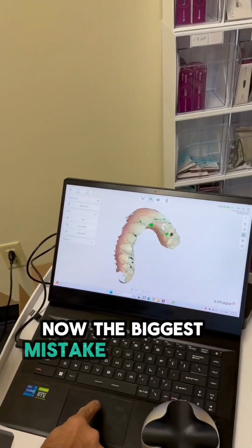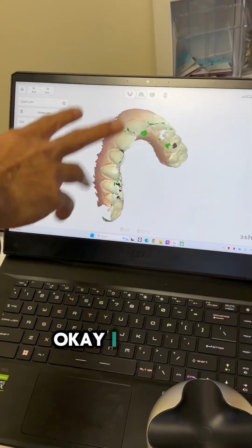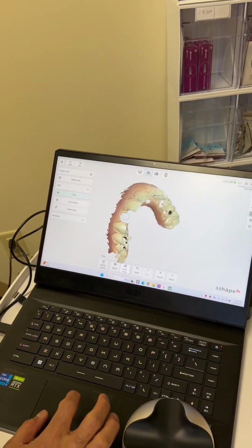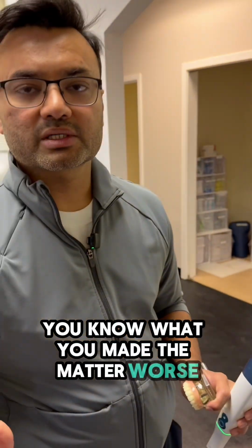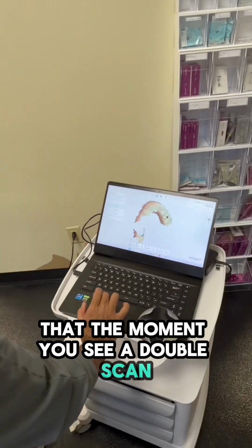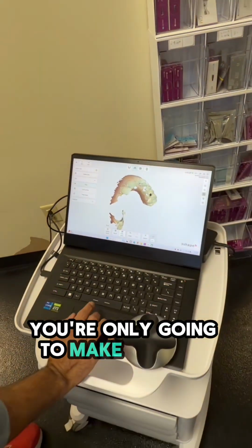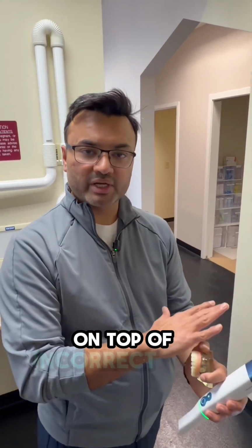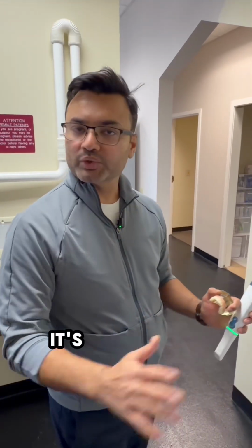Now the biggest mistake that people will make is that I already got a 639 image count, okay, I got an overlap. What I have seen people start to do is trim the areas where there's double image. You know what? You made the matter worse. I will tell you from experience, the moment you see a double scan, do not waste your time trimming anything. You're only going to make matters worse, because now you're piling incorrect image on top of incorrect image, and you're only gathering bad data. It's no use for anybody.